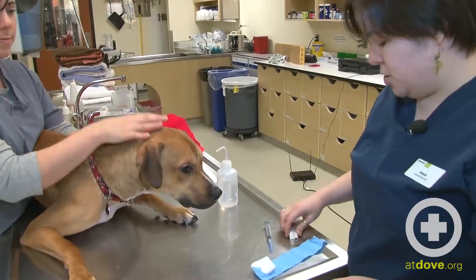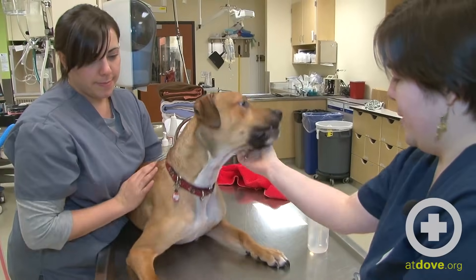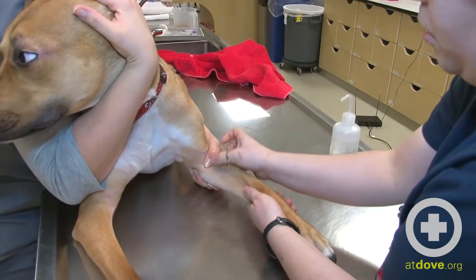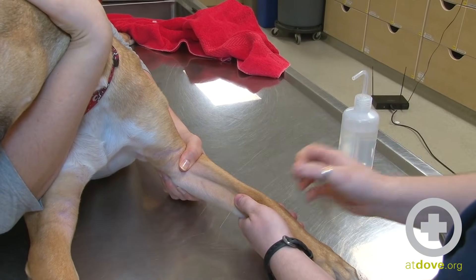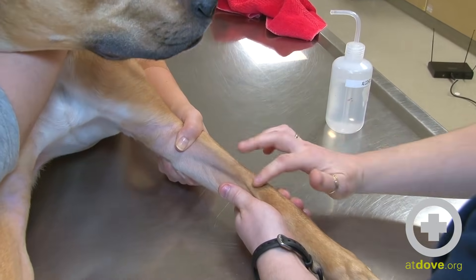So I have my syringe, my blood tubes, my band-aid, and my lovely restrainer, and we are going to try and position so that I can get a nice look at the vein. She's going to hold off the vein while rolling outward so that it kind of puts the vein along the top of the leg. When I wet the vein with alcohol you can really see it start to pop up right there.